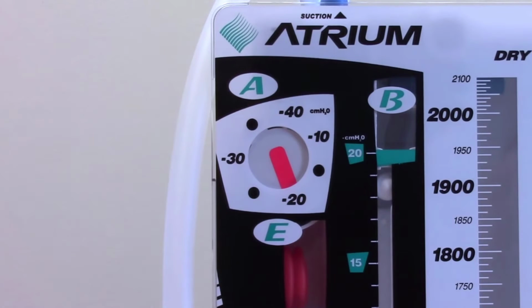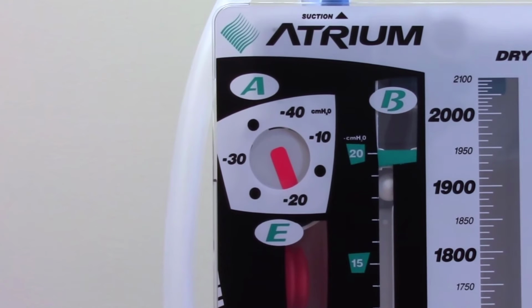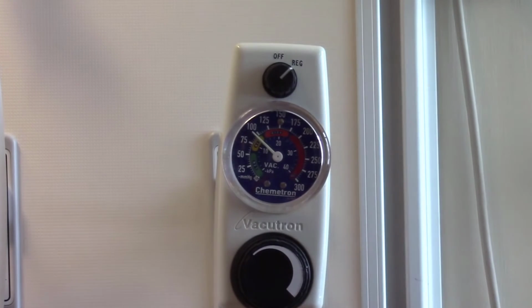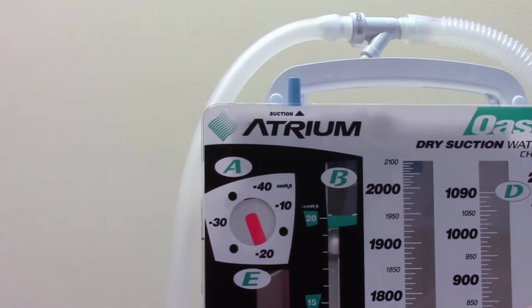Finally, ensure that the drain's dry suction regulator is set to the right setting and that the orange suction monitor bellows is expanded to the triangle mark. If the bellows is not expanded, check that your suction tubing is connected and not obstructed. Ensure that the wall suction regulator is on and turned up enough to expand the bellows. If the order prescribes water seal, you will disconnect the wall suction from the suction port of the drain. The orange suction bellows will no longer be expanded.